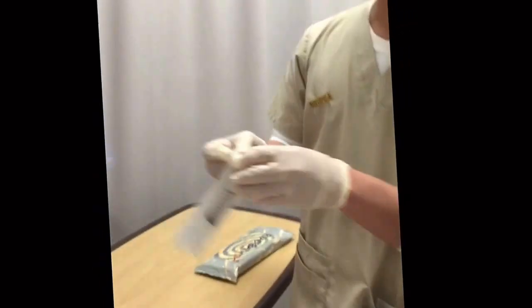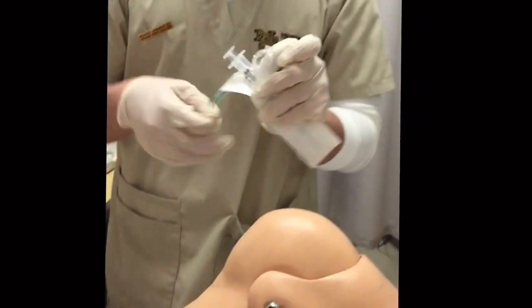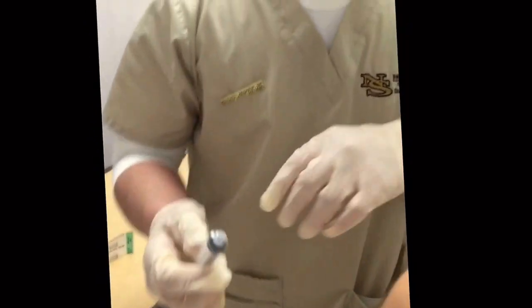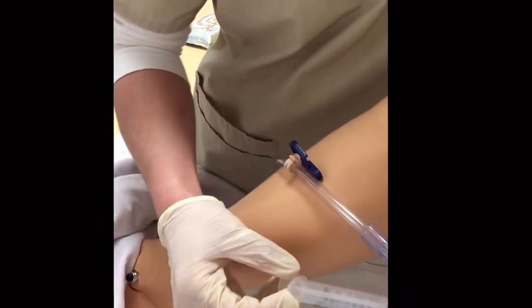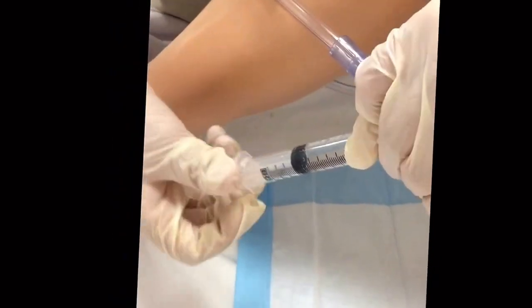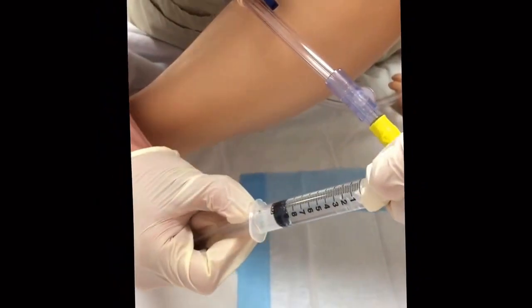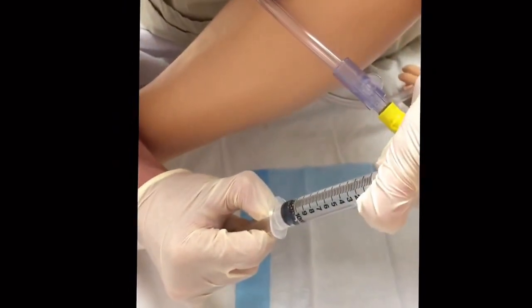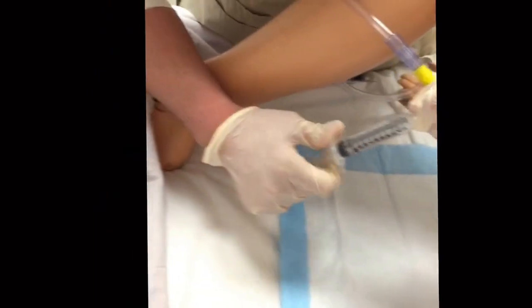And you need to use a sterile syringe for this to always deflate the balloon, take all the water out or the air out before you take the catheter out, okay? So just go grab it like this and go ahead and make sure you know how much you put in. Well, I put in 10 ml, so make sure you take 10 ml so it won't have any extra water. How you feeling, Miss Susan? Okay so far. Alright, that's good.